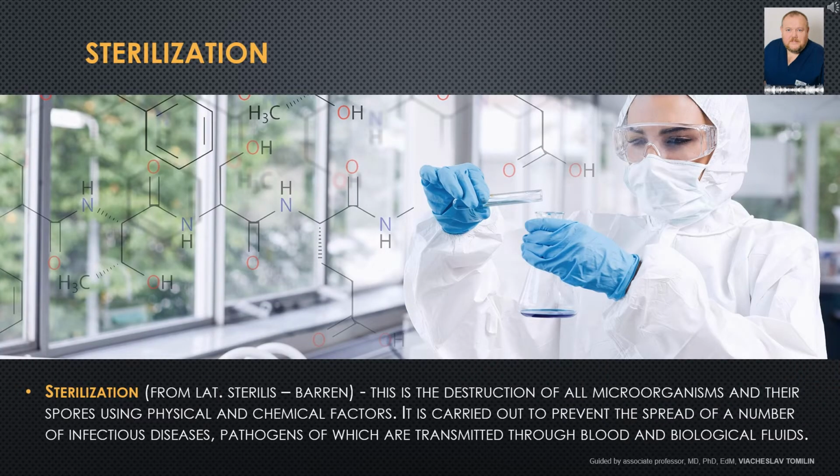Sterilization. From Latin sterilis, barren. This is the destruction of all microorganisms and their spores using physical and chemical factors. It is carried out to prevent the spread of a number of infectious diseases, pathogens of which are transmitted through blood and biological fluids.